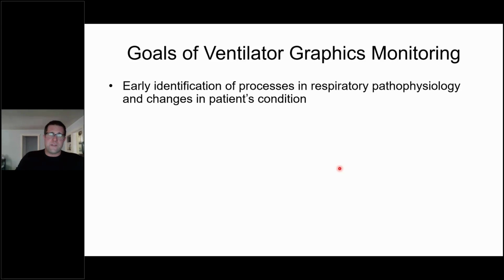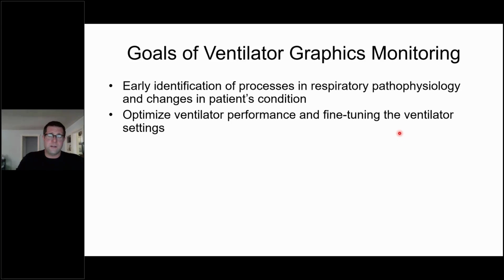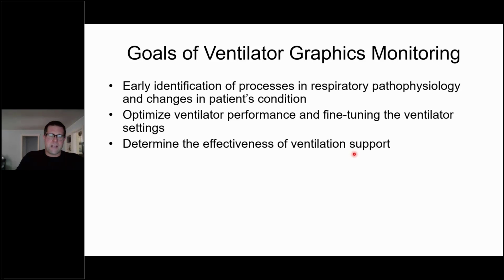And so we can identify early on some of the processes that lead to changes in pathophysiology and the patient's underlying condition. We can adjust the ventilator and fine-tune the ventilator. It's our tool. It's a bridge to support the patient, but ultimately, it is up to the clinician, respiratory therapists or physicians, and even nurses, to identify whether a patient's not doing well and be able to look at the graphics. I mean, we'll go up there with the thumb drive and grab these graphics in real time and then fine-tune the ventilator, and then use those graphics to share with people so that they can understand that there are simple manipulations that you can make in order to improve the patient's interaction with the ventilator.